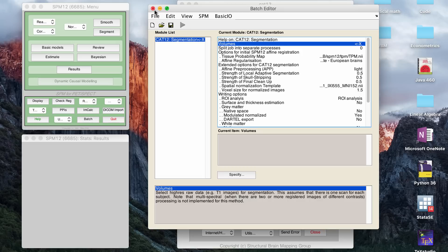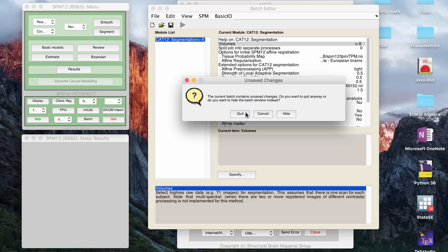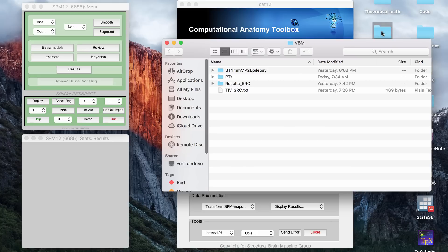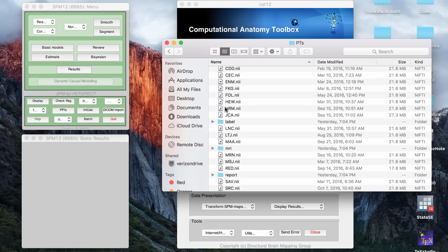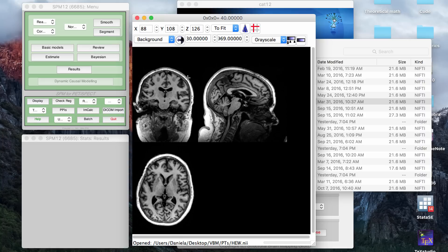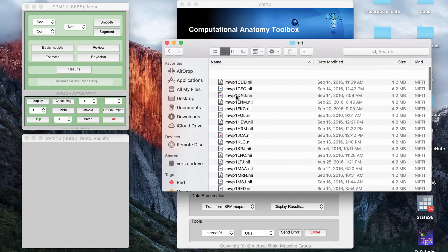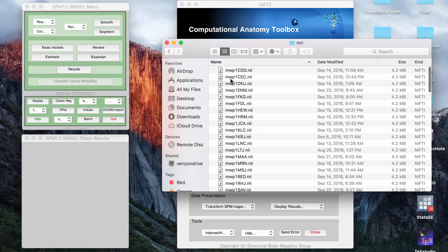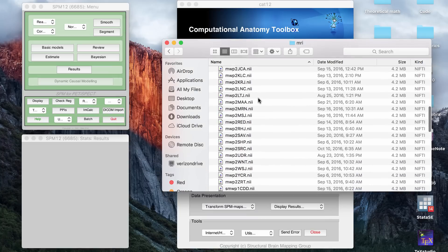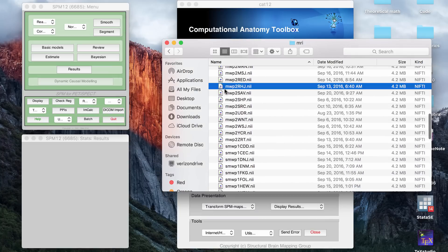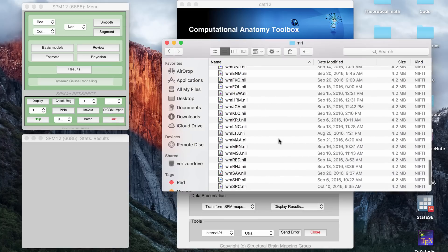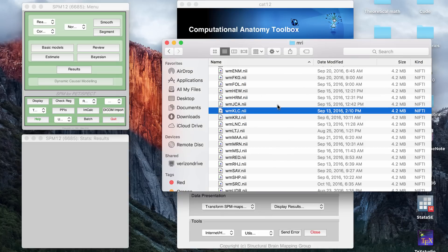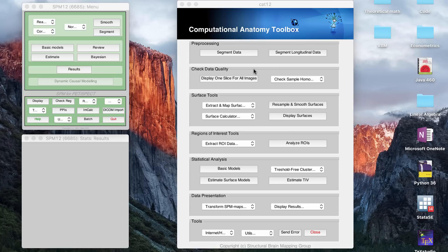So you put in all the files, and then what that does is it will create gray matter and white matter files that are separated, and these are NIFTI files. So if you go to whatever folder you had your NIFTI files in, so this is an example of data I was inputting, and then it will create an MRI folder, and you will have what are called MWP1 files, and so these are gray matter files. It will have MWP2 files, and it will have white matter files.